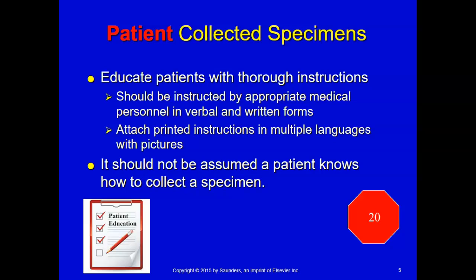And I'll tell you the most interesting samples that I ever had. One was a stool occult blood. It's just a card that you open up, and it has filter paper on the inside. And the patient is supposed to take some stool with a popsicle stick or swab and smear it on that filter paper and then close the cardboard card packet back up. Well, we had one time, and the stool was all over the outside of the card. The patient had never opened it. So that's not really good.